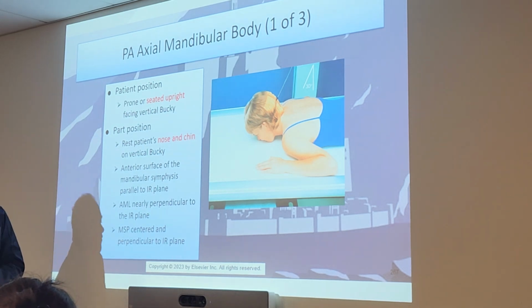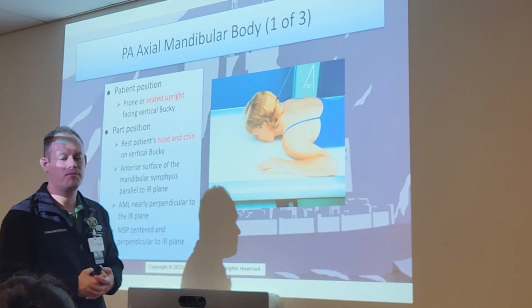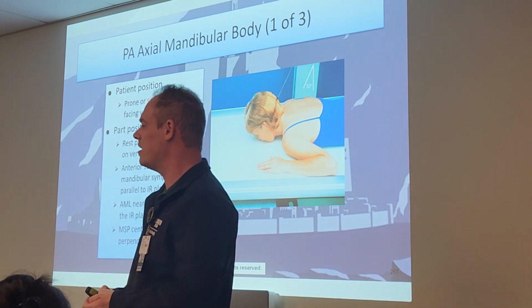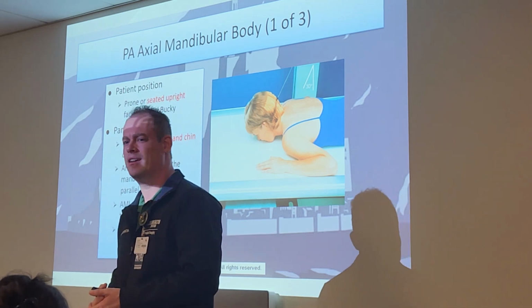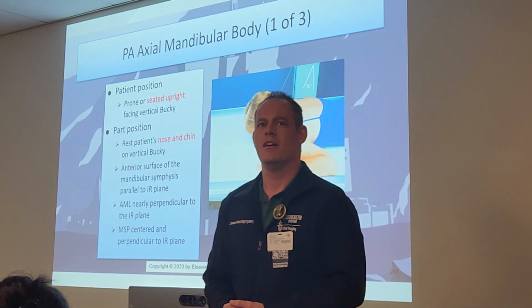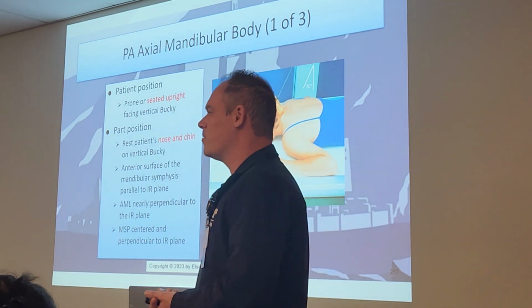We are going to have the patient preferably seated upright, not prone like you see in the picture there. That would not be ideal. Also very uncomfortable if their chin or their mandible is dislocated. I wouldn't be putting them on their chin like that. That's probably not going to be a good time. Or put them in the Panorex. That'd probably be the easiest way to do that.